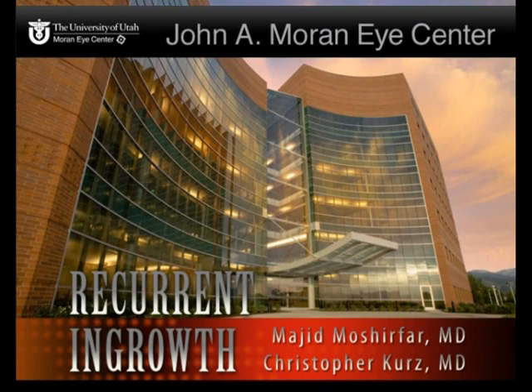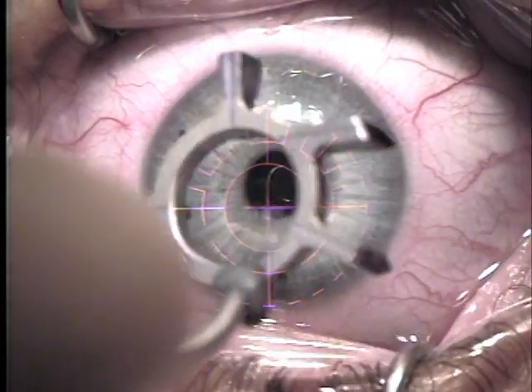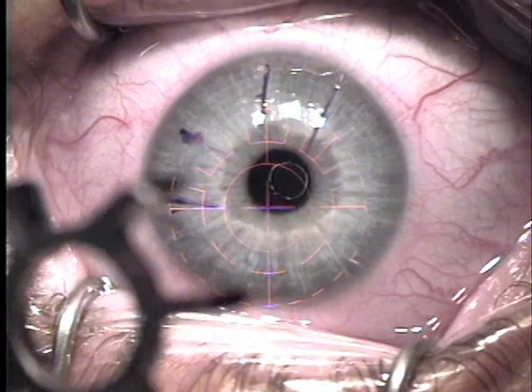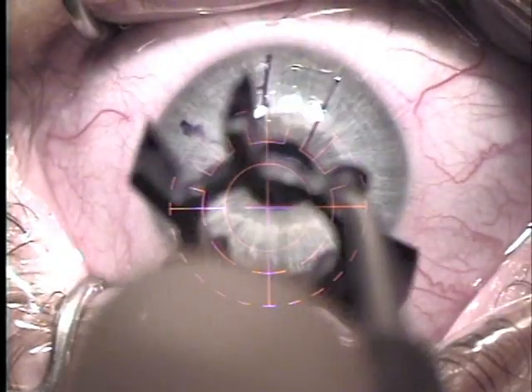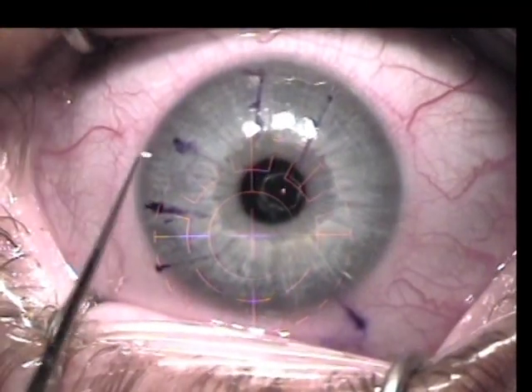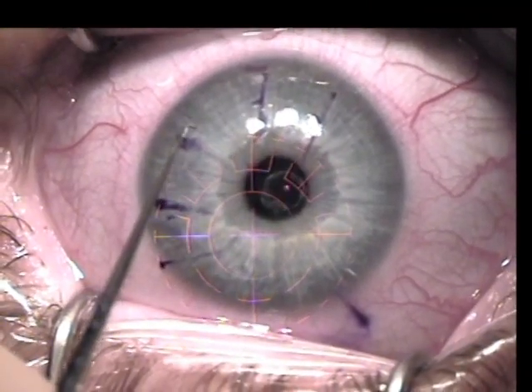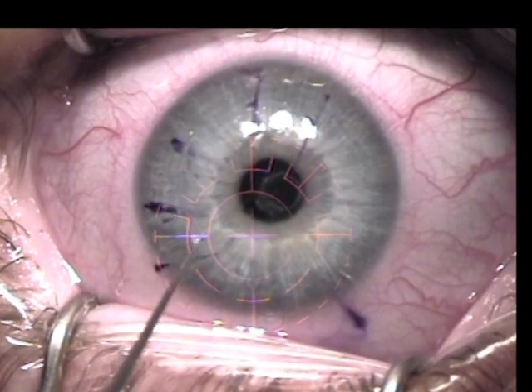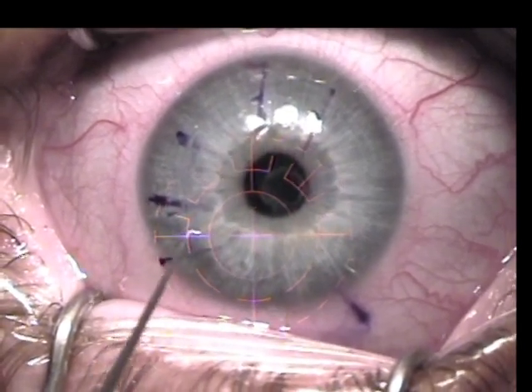This is a case demonstrating the treatment of multiple epithelial ingrowth status post-LASIK. The LASIK flap is first marked, and the Osinski hook is used to free the borders of the LASIK flap for 360 degrees.